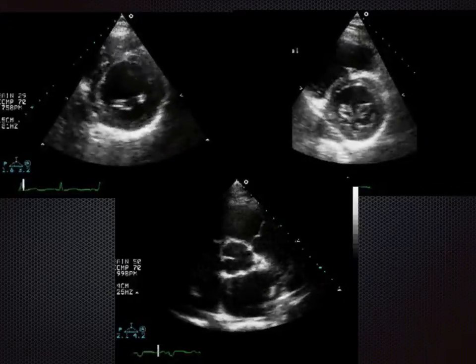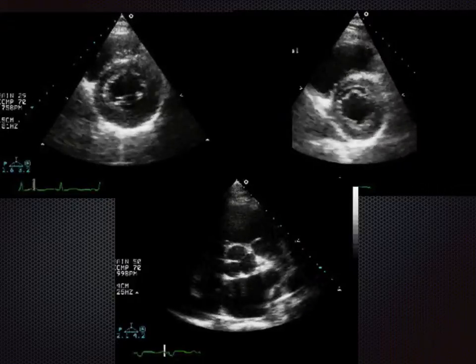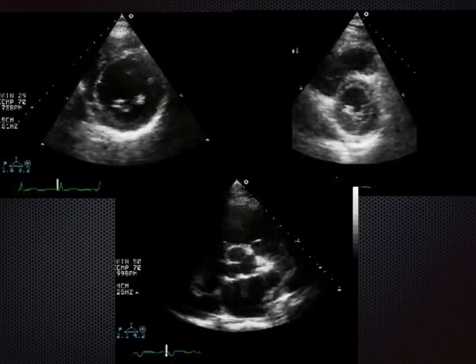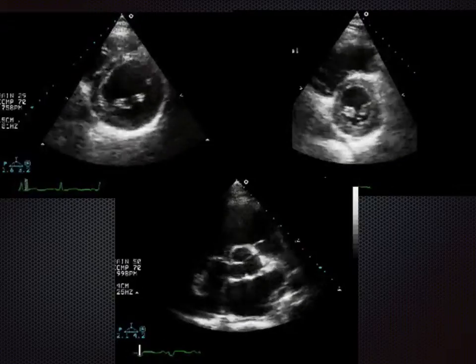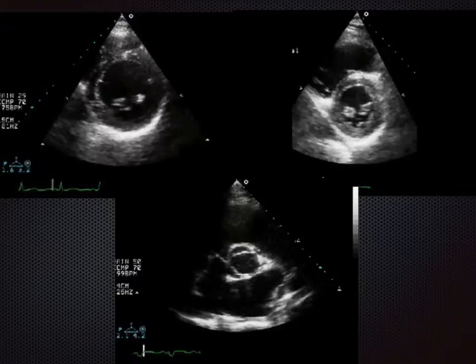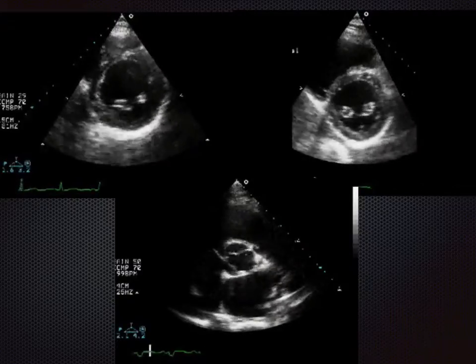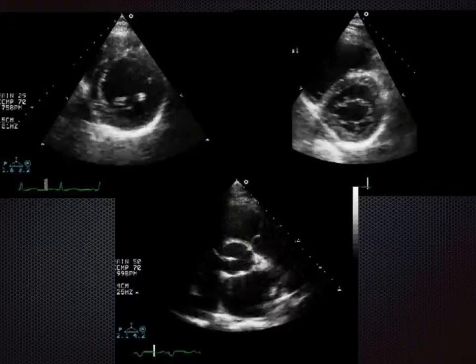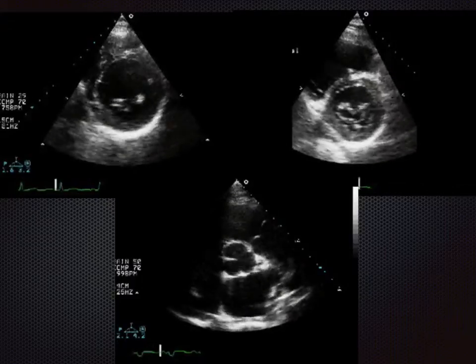So below the aortic valve is a left atrium, below and to the left of the aortic valve is a right atrium, and you can just make out to the left of the aortic valve something opening and closing, and that's a tricuspid valve, and something at about the 2 o'clock position on the aortic valve is another thing that's opening and closing, that's a pulmonary valve.